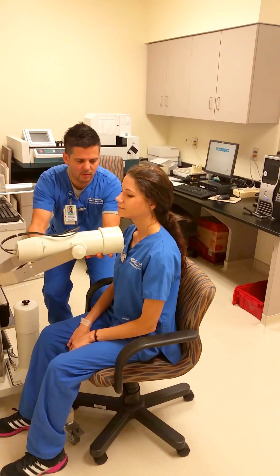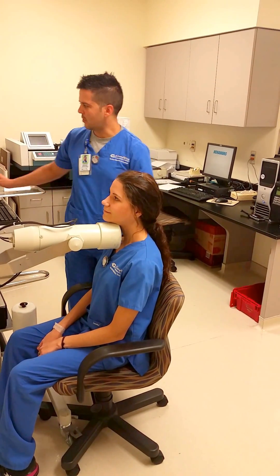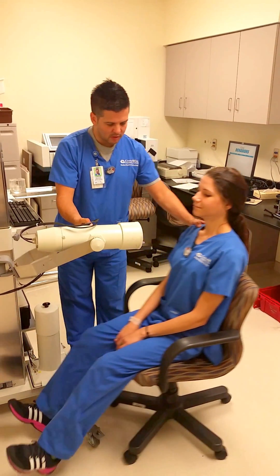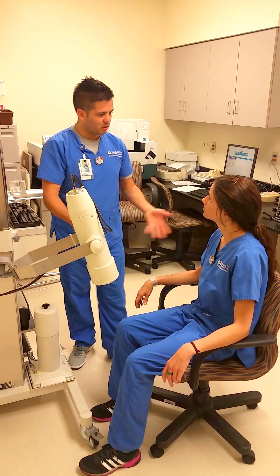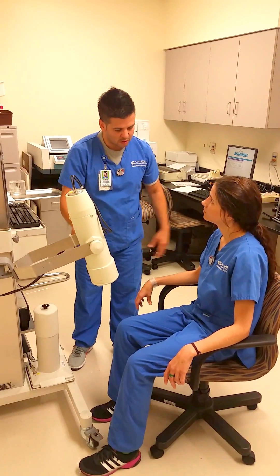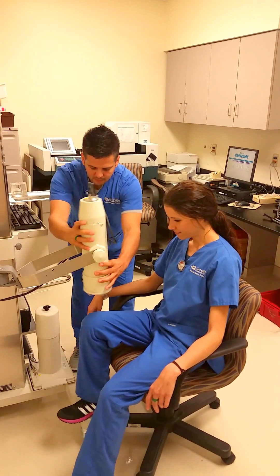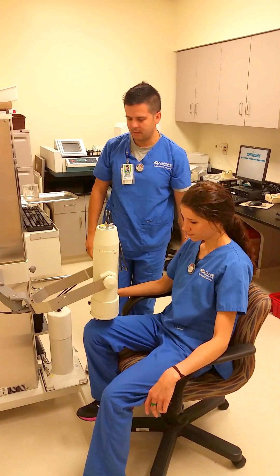Sit up straight for me — scoot forward a little bit. So this is going to count for two minutes. You can back up now. It's going to take a background measurement because iodine circulates through your system, so it's going to take a comparison reading from your other tissues, which we do on your thigh. So I'm going to have you put your foot up there for me. Count for another two minutes.